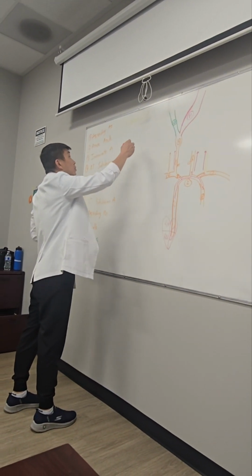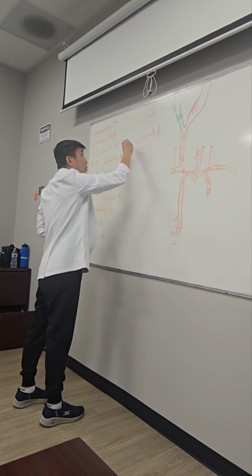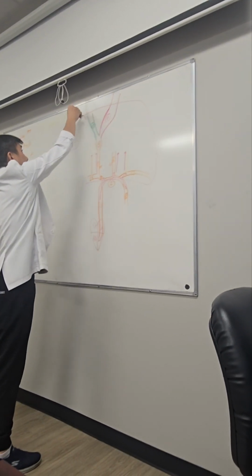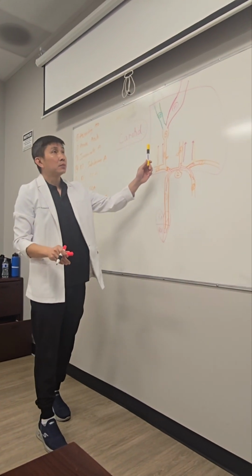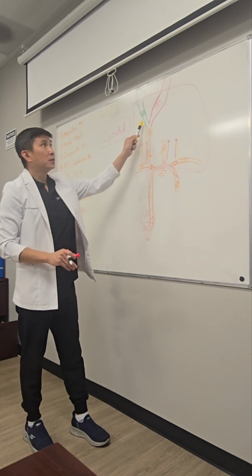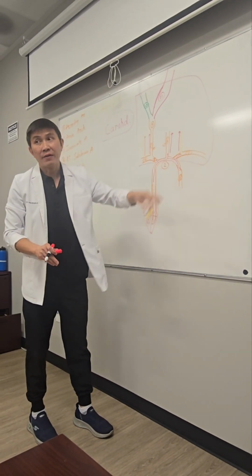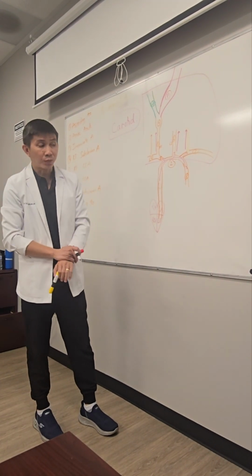For the extracranial vessel, or just carotid, protocol, what should we check? We check from here, which includes the right and left CCA, both ECA, ICA, vertebral, and subclavian. We have to check everything. That's included in the carotid protocol.